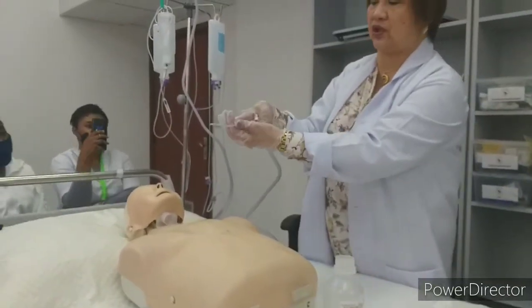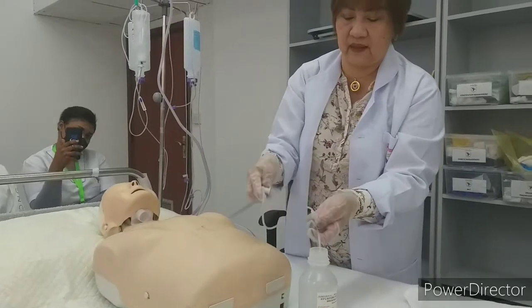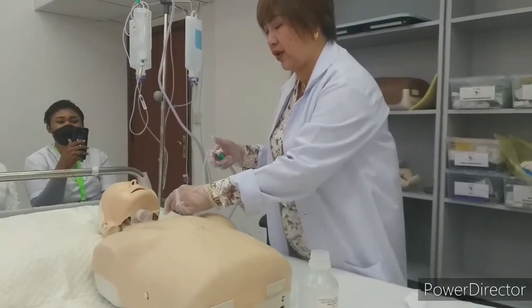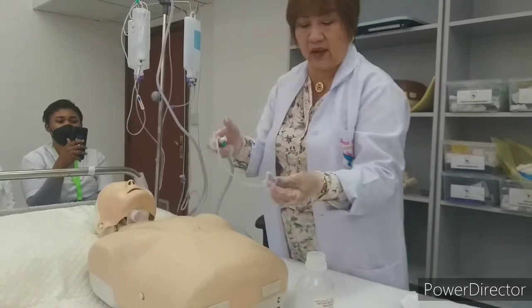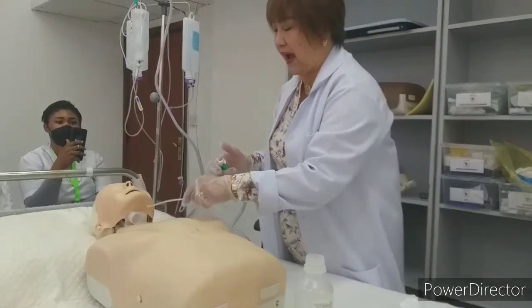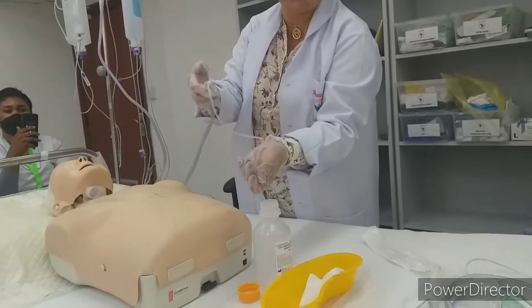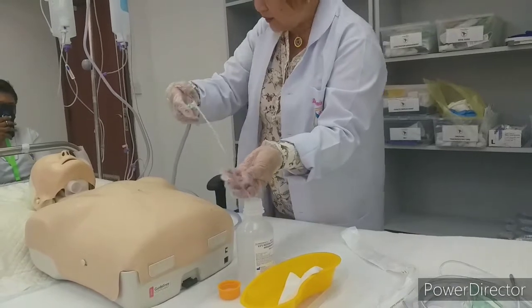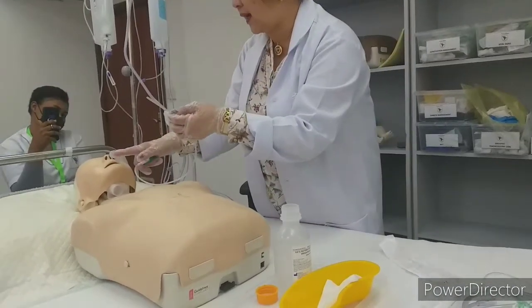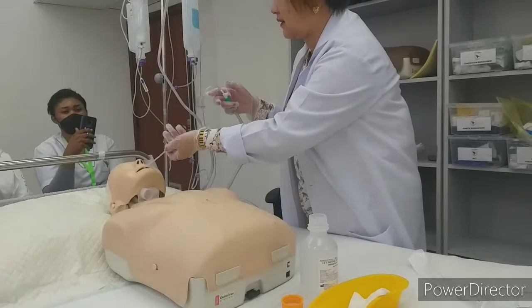Put it on, set to 1. Get your suction catheter, roll it on your finger, dip to test, and close, suck out. Go to the patient, to the tracheostomy, insert, suck out. Go back to the saline to clean. Suck in, suck out. Back to the tracheostomy, suck out. Back again to clean. You will find that the secretion is coming out and going to the canister. Now, we saw the mouth is full also, so the same catheter you can use inside the mouth.